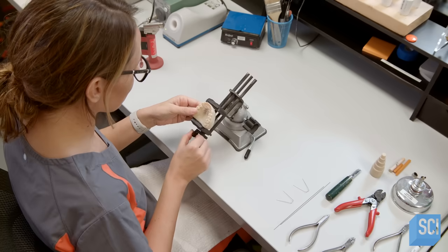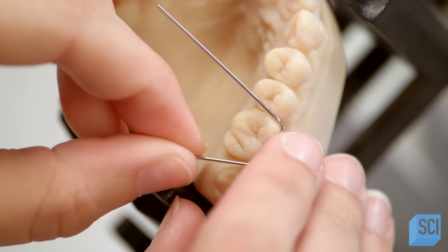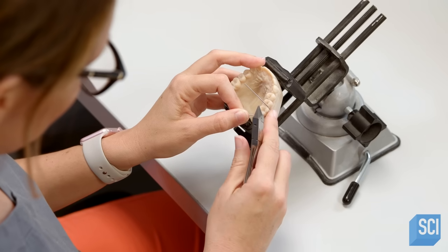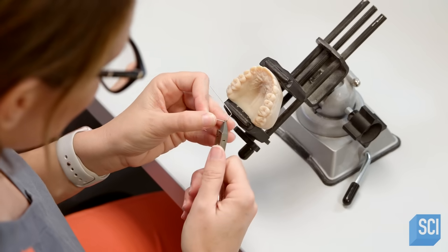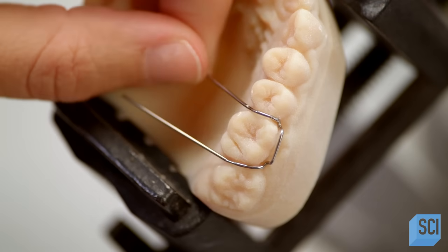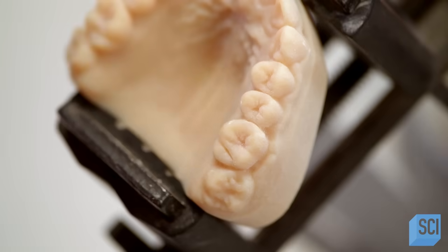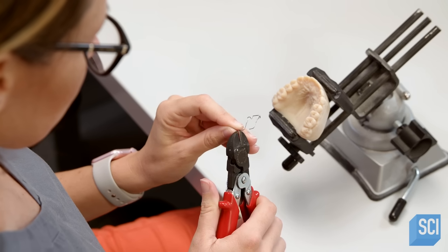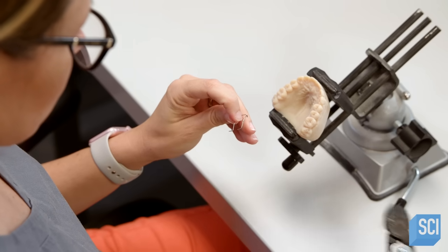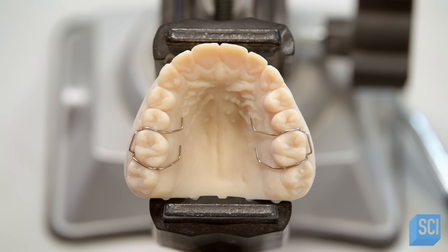A technician places the model in a vise. Using a preformed clasp made of stainless steel wire, she fits the wire around the first molar, bending it with pliers to fit snugly around the tooth. Then she bends the end in a specific shape. This step will help to anchor the wire in the retainer's acrylic pallet at a later time. She clips off excess wire and repeats these steps for the opposite side.